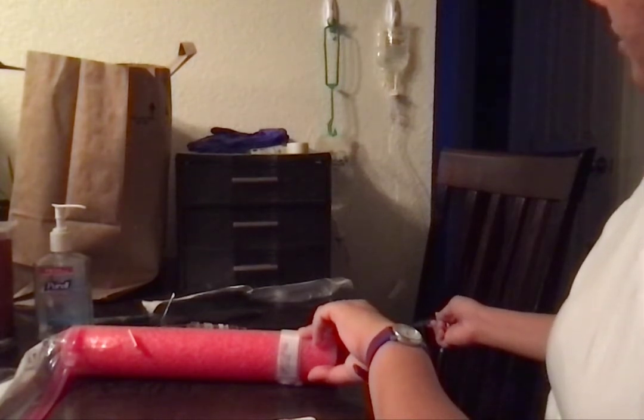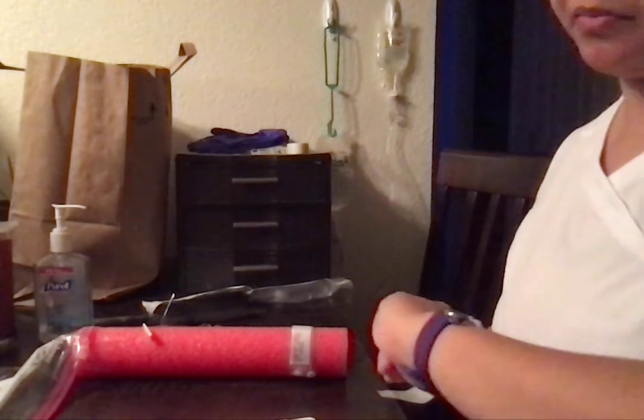Start counting. 1, 2, 3, 4, 5, 6, 7, 8, 9, 10, 11, 12, 13, 14, 15, 16, 17, 18, 19, 20, 21, 22, 23, 24, 25. Okay, perfect.